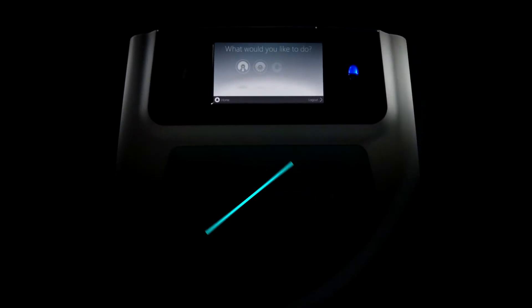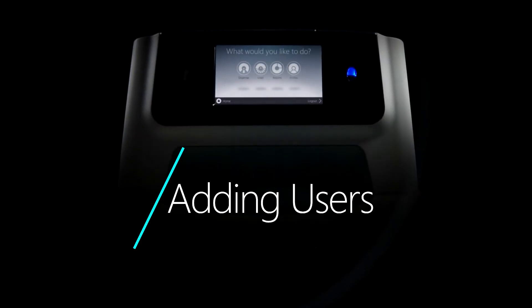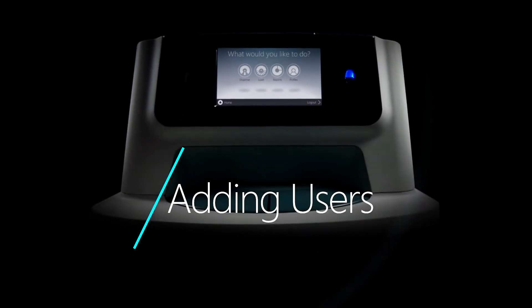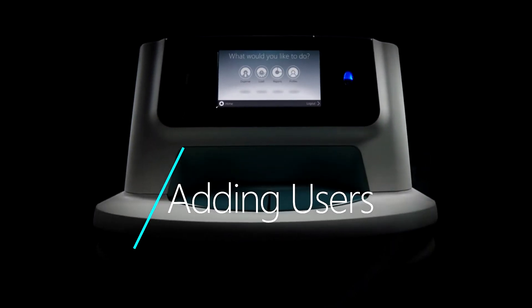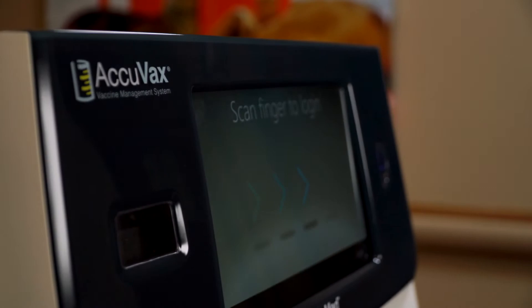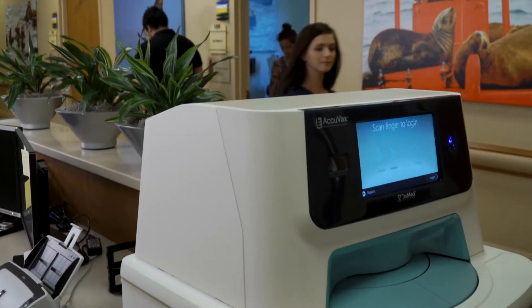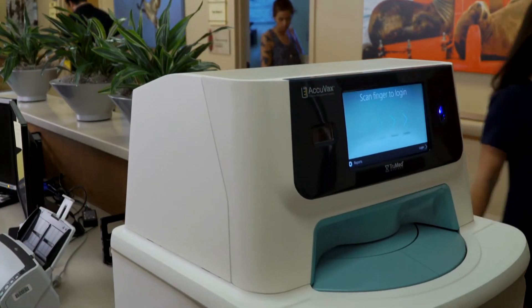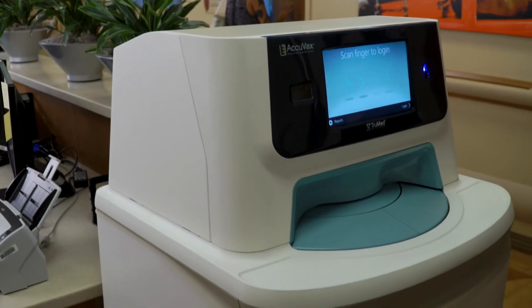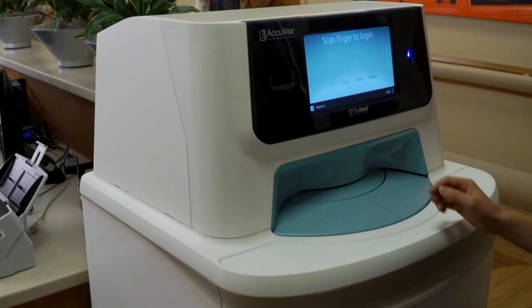Adding a new user to your practice's AcuVax is a short process that can be accomplished in minutes. First, log on to the AcuVax using the fingerprint scanner.